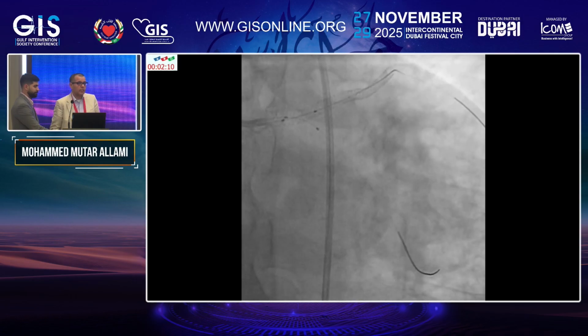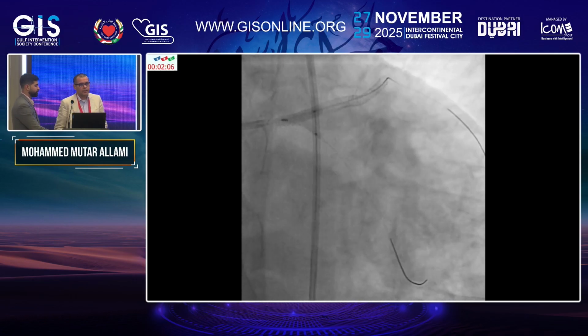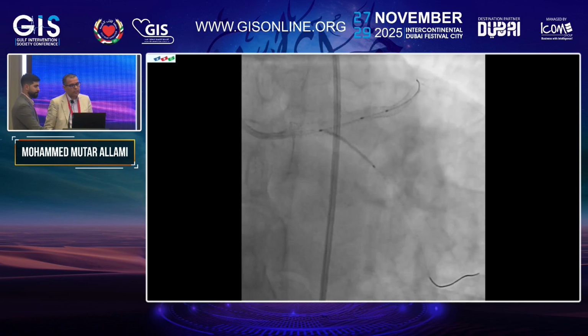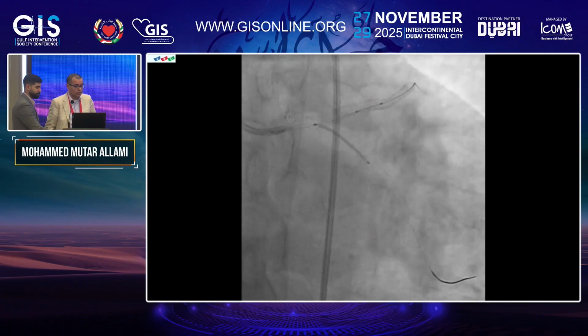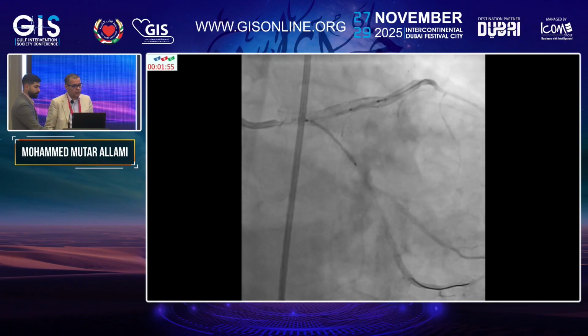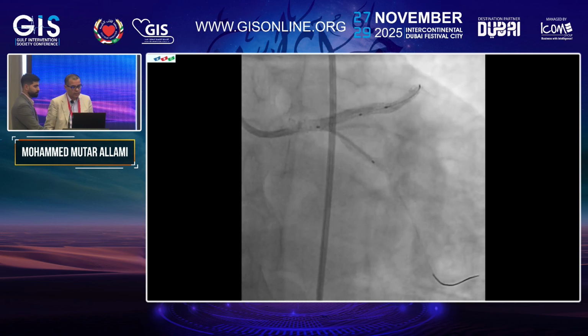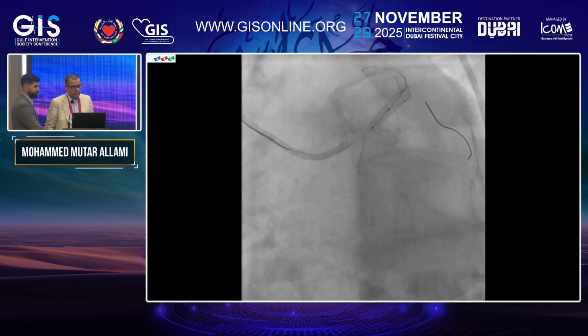But unfortunately, the result after the final kissing balloon dilatation was suboptimal. So I decided to stent the circ. This is a 3.0 by 18. My approach was inverted crush. The stent protruded approximately 2-3 millimeters inside the left main, with the balloon in the LAD. Then, after deployment of the stent, the crushing was done by a 3.5 NC balloon.